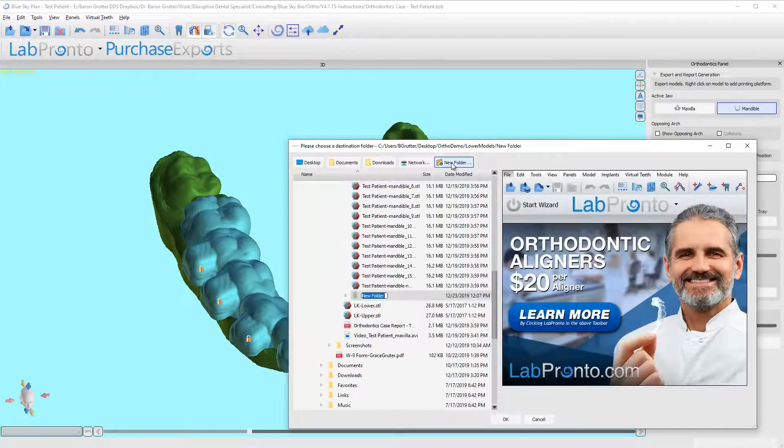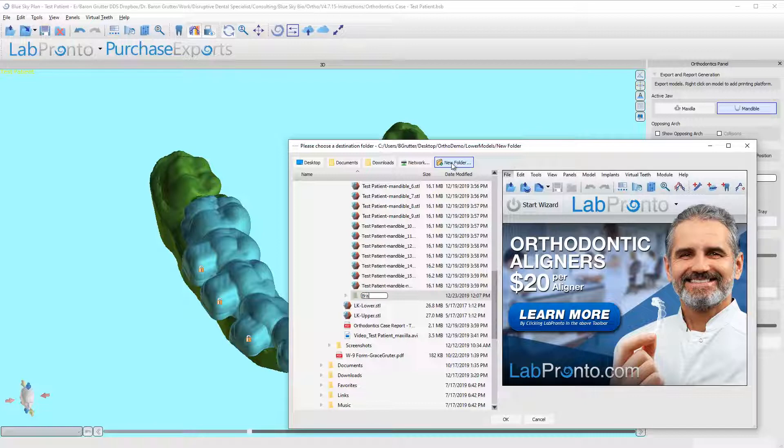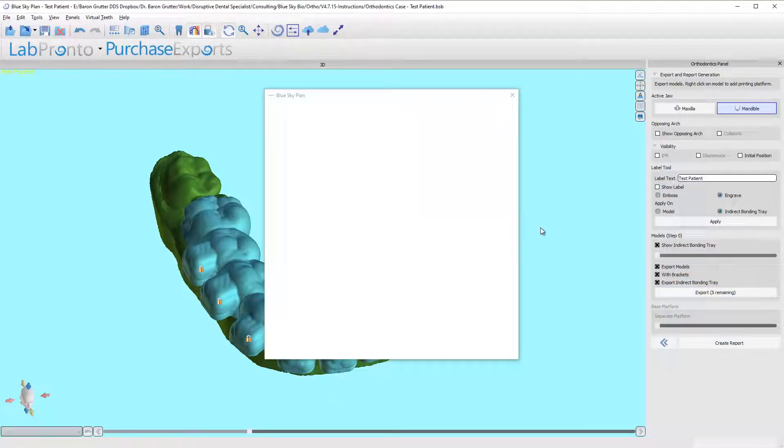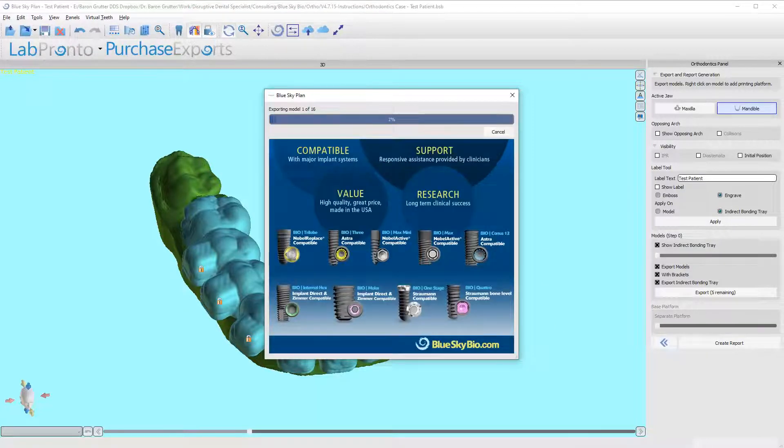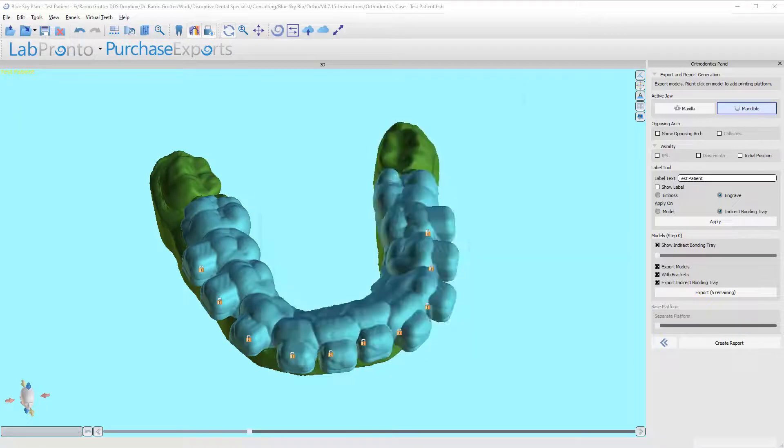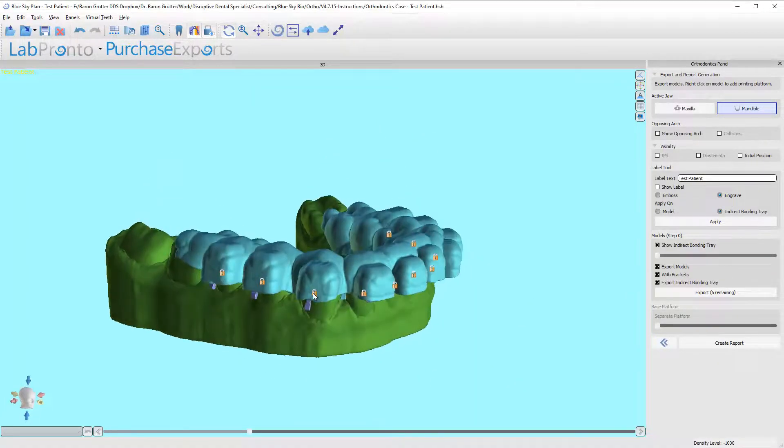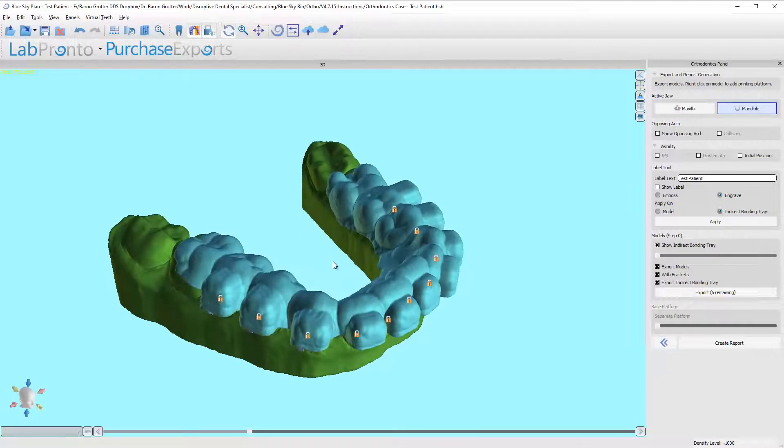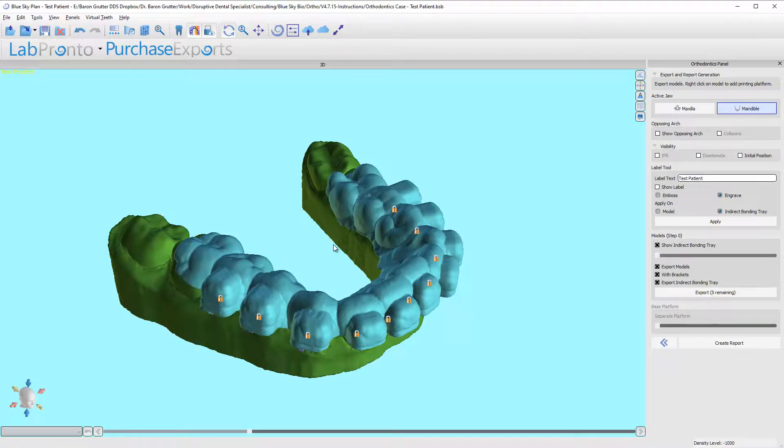And I'm going to make a new folder—I'm going to call this IBT files. Okay, and it's going to take a little while to export because it's going to export all of those individual files, so go ahead and get your second cup of coffee. Okay, so it's all done exporting. We are basically all done. In this next quick video, I'm going to show you how to print your IBT tray or at least how I like to do it.